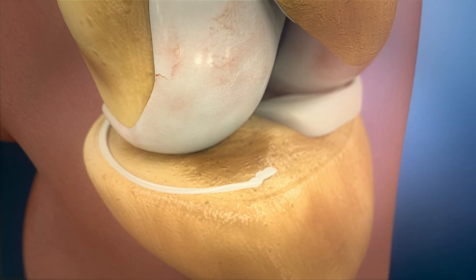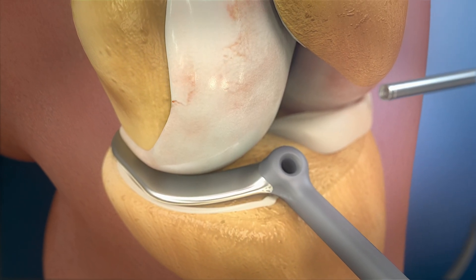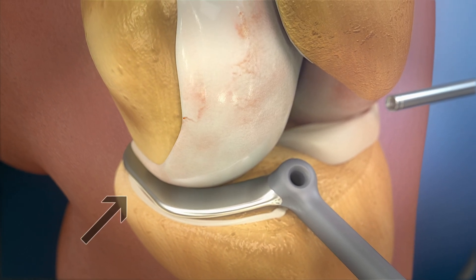The correct size of the needed implant can be determined when the trial sizer lies flat on the tibia plateau and the far medial edge of the tibia plateau is still visible.